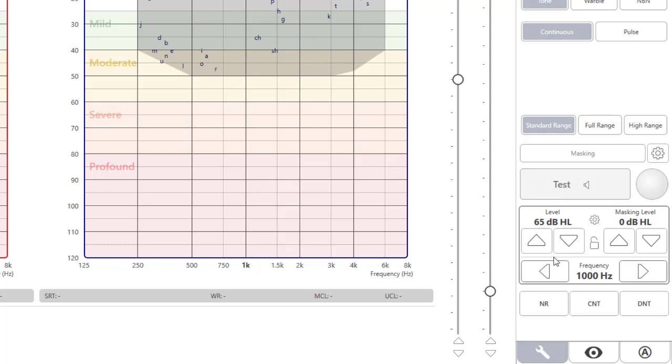To lock the masking level, click on the lock icon. To change frequency, use the frequency level controls. Keyboard operation of the audiometer will be covered in the audiometer training video.